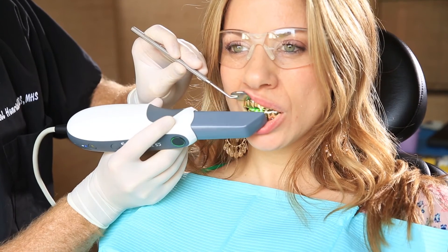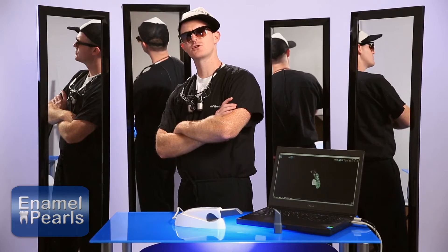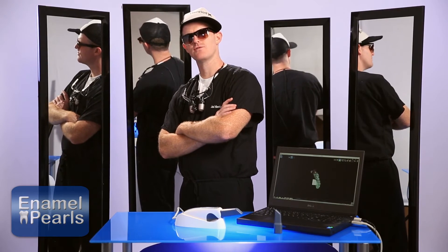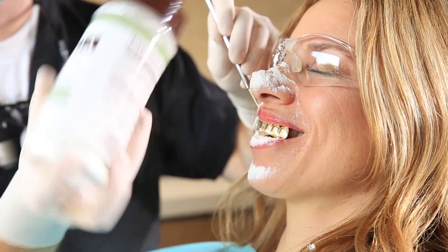Angling the scanner affects the direction in which the shiny surface reflects light. Number two: you can use anti-reflective powders or a micro abrader to roughen the shiny surface and decrease the reflection.